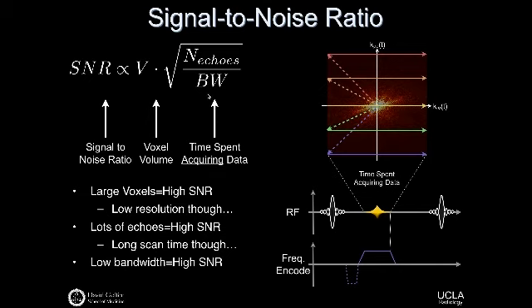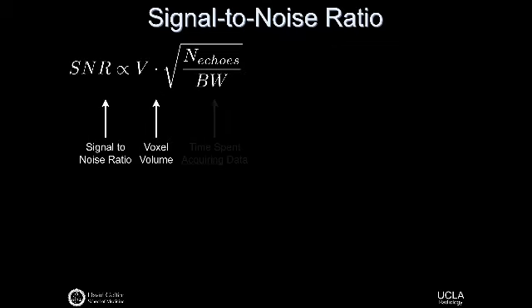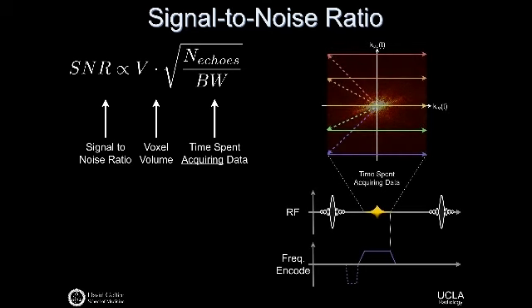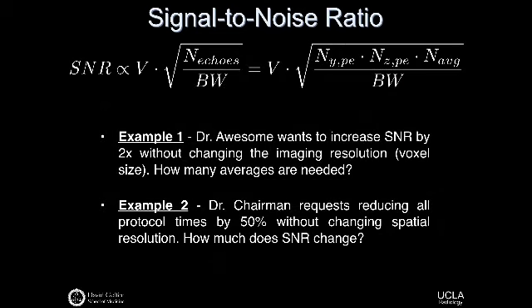We also see that if we lower the bandwidth here, that will in fact give us higher signal to noise. But lower bandwidth, sorry, I should have put it in there. Lower bandwidth is associated with chemical shift artifact. And so we don't always want chemical shift artifact type 1, where you have this spatial misregistration of fat and water. And that can be sort of confusing diagnostically, at least. So we can further expand this a little bit and then look at some examples.